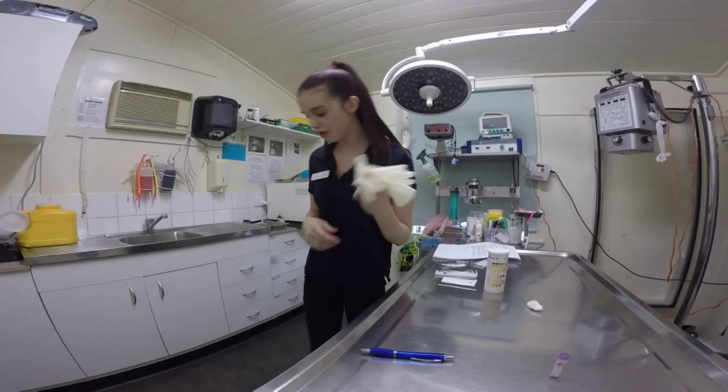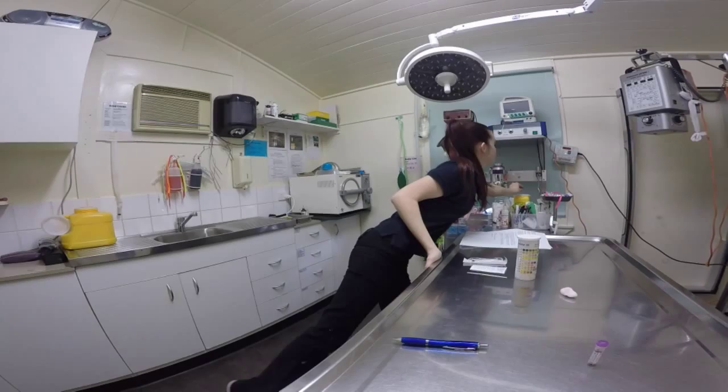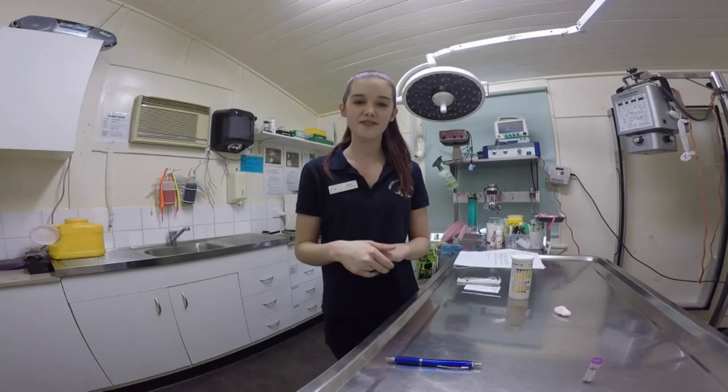All rubbish will go into the bin including the fur, and the needle will go into the sharps container. Once the blood results are back we will pop them onto the animal's file and the vet can evaluate them.